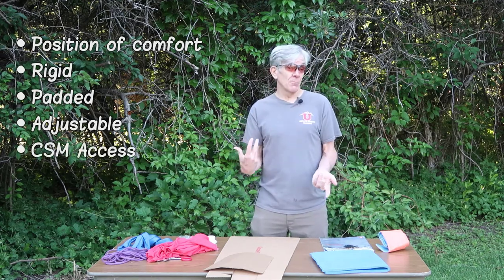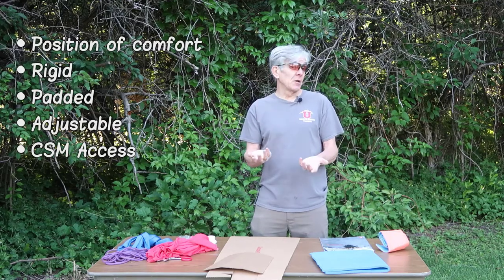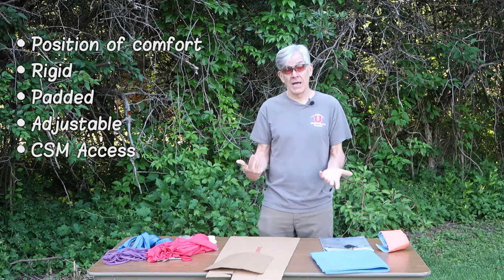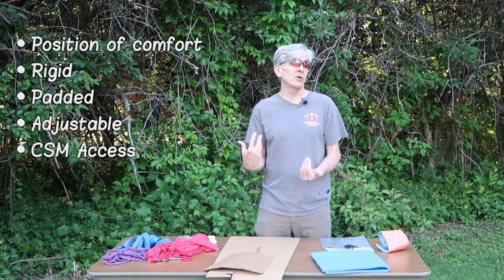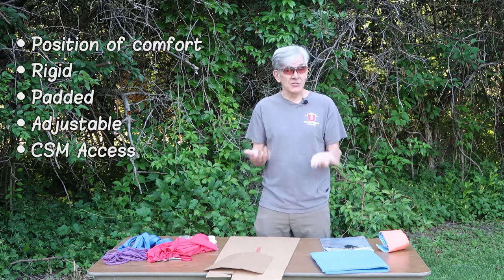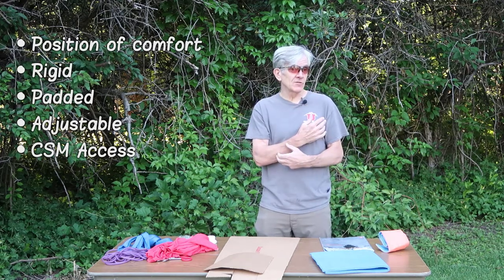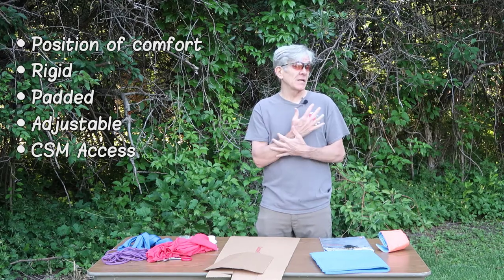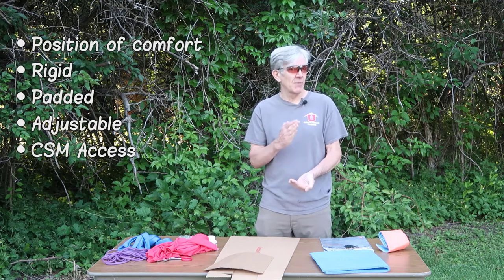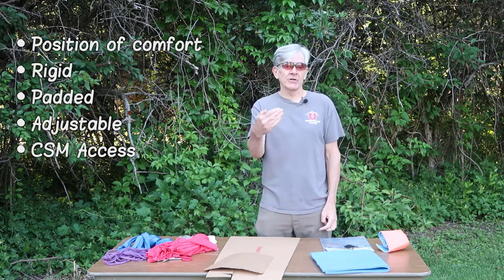CSM access is important — circulation, sensation, and motor function. A key principle of splinting is that we want to check CSM before we apply our splint and after we apply it. For example, you may have a patient who had a dislocated shoulder that you've successfully reduced — it's likely you'll have some sensory deficit following that reduction, but you want to recheck after splinting to make sure your splinting didn't cause additional deficit. We always check CSM before and after, and we want access to check it periodically throughout transport.